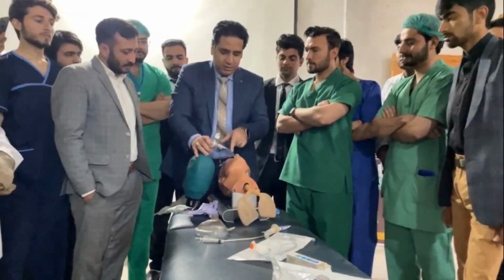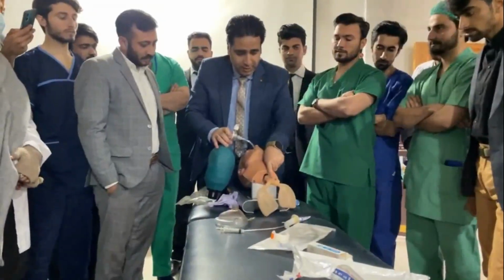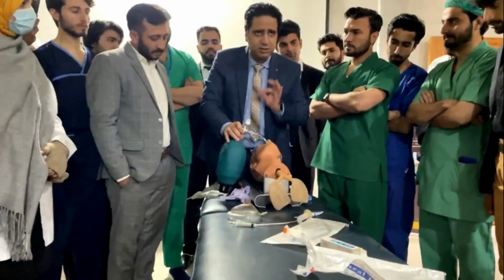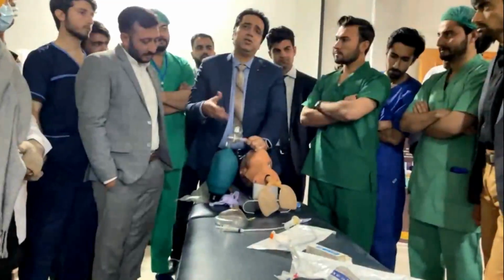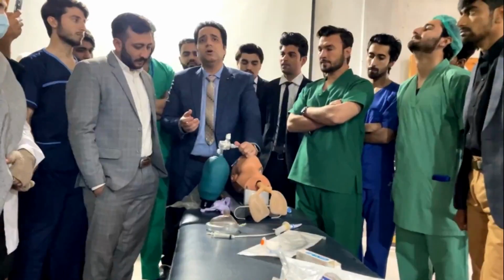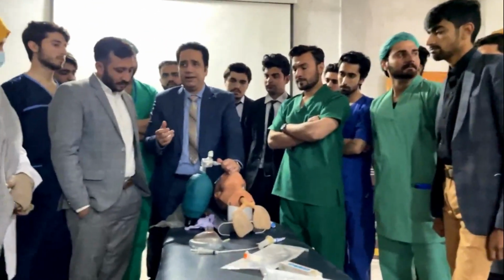Now, in placing the tube, this is the bifurcation of the trachea into the two bronchi. What people do most of the time is insert the tube a little bit further, so that the patient ventilates by only one lung. That's called single lung ventilation, and the patient's saturation doesn't come up with that.